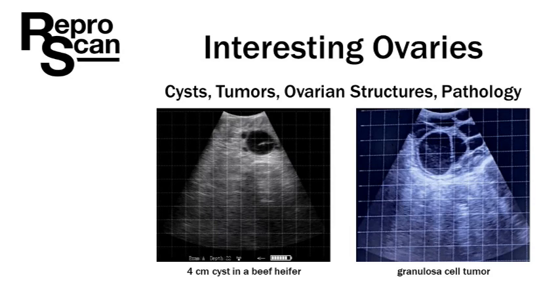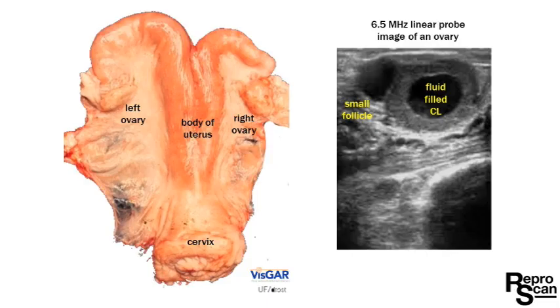Welcome to the Reproscan video called Interesting Ovaries. In this video, we will be looking at cysts, tumors, ovarian structures, and some pathology. First, we're going to go back and review the normal reproductive anatomy.